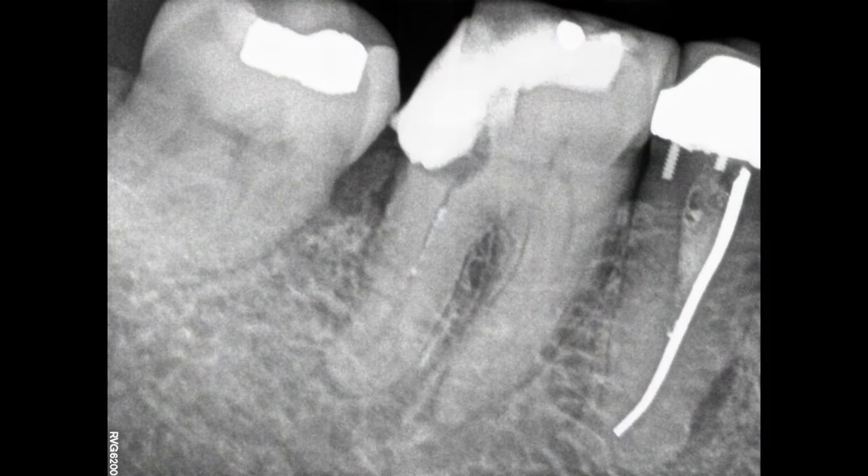There's a pretty good ripple in that area, and when it's actually working it does seem to make a significant difference. I have a few video clips later in this video that are not stabilized, so you'll be able to see the difference. What I was trying to do here was get that IRM cleaned out and out of the way, and now I'm going to be doing the truss access.